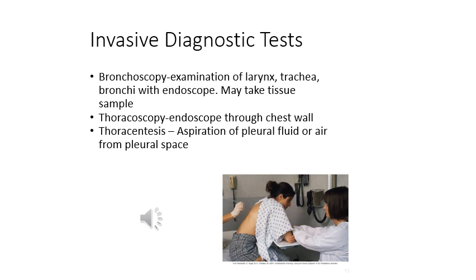A chest tube is possibly placed at this point in time. And then you want to check that site for bleeding and leaking after the procedure is done, and encourage deep breathing for lung expansion.